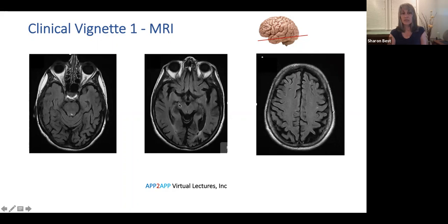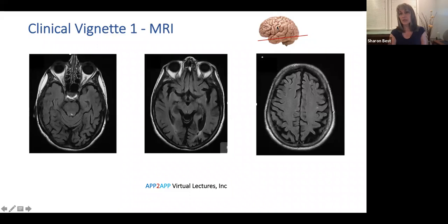As we scroll superiorly, the brainstem changes to the shape of the midbrain — looks like a butterfly — and we can see very chunky sulci in the temporal and occipital lobes: atrophy in bilateral occipital lobes and also in the left temporal lobe. As we move further superiorly, we're above the temporal lobe now, and we can appreciate that about half our slice is frontal and half is parietal. We can clearly see much more significant atrophy in the parietal lobe, left worse than the right.